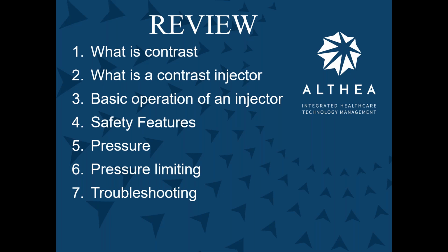How many times does the CVI have to be purged before it's happy? It's a minimum of 3 or 4 times. I think that screen asks you 4 times minimum, purge, purge, purge. And it knows if you purged or not. It does. There's a sensor in there that will see a little BB go up and down and a sensor to say, no more air.